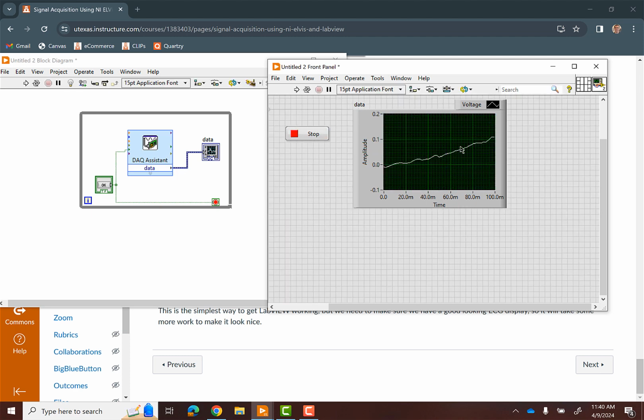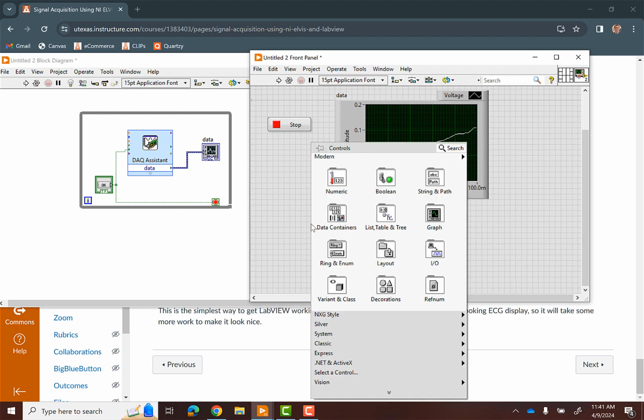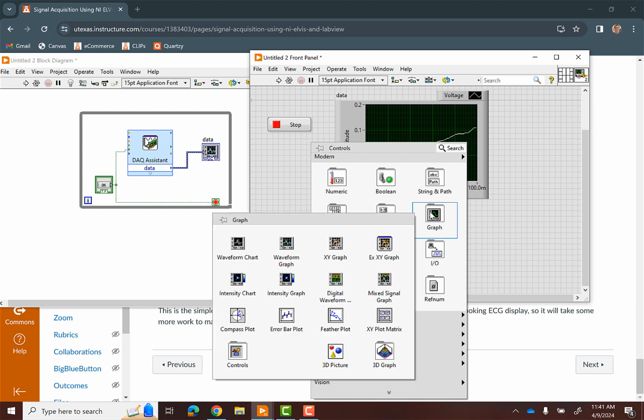But we wanna make a LabVIEW display that actually looks good, that actually looks like a real ECG device, right? And so one of the problems is when I told you to add a graph indicator, it made a graph, okay? And this is a graph. Now, for ECG data, it's better if we would use what's called a chart, okay? And so we can add a chart here instead of a graph. And so there's a couple ways to do that. The easiest way is just right-click on the background of your front panel. So it's gotta be this front panel because we're gonna add a chart to there. And there's this menu graph. And so you can see there's a difference. There's a waveform chart and a waveform graph, okay? So right now there's a graph being used. We wanna use a chart instead.